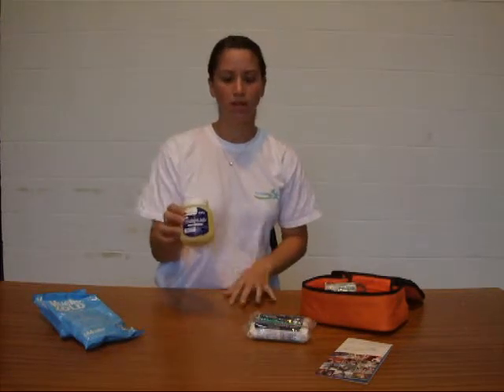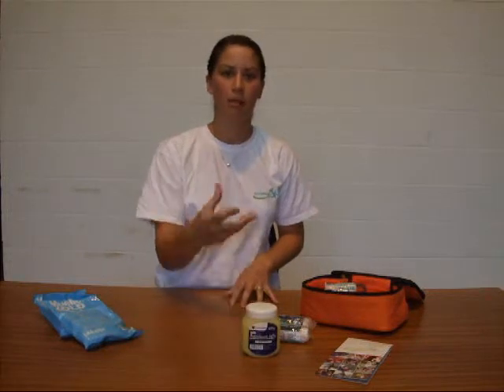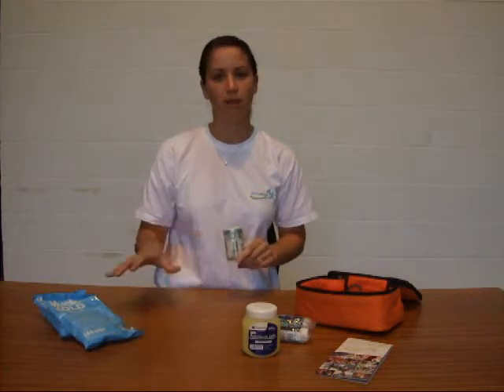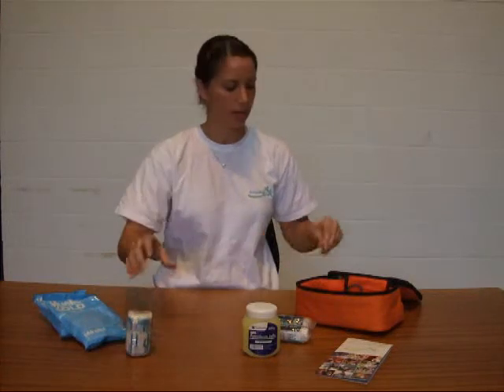We've got some petroleum jelly or Vaseline, just to stop any friction burns from happening if your shoes are a little bit tight. We've also got a crepe bandage with its own fastener on it, so you can wrap that round the Muller Cold just to keep that in place on any knee or any injury like that.